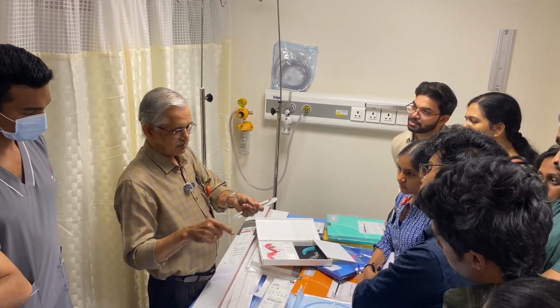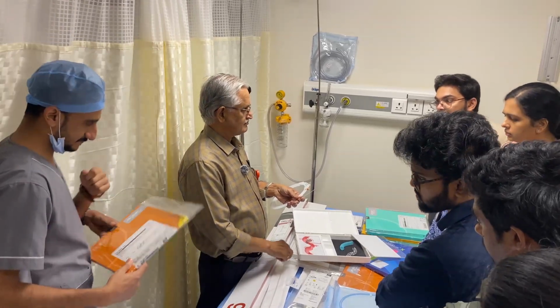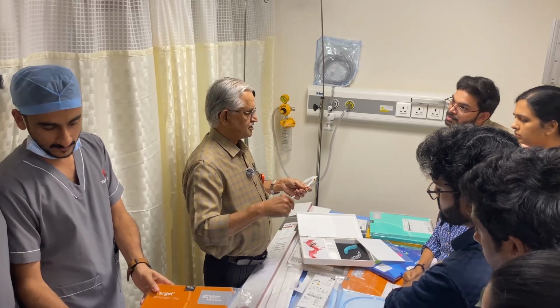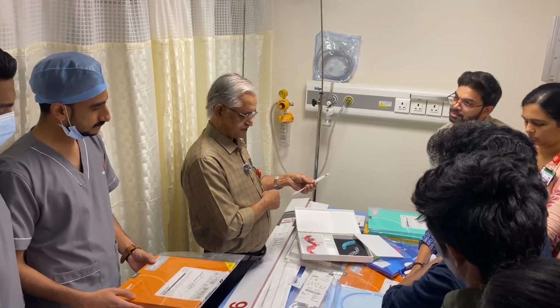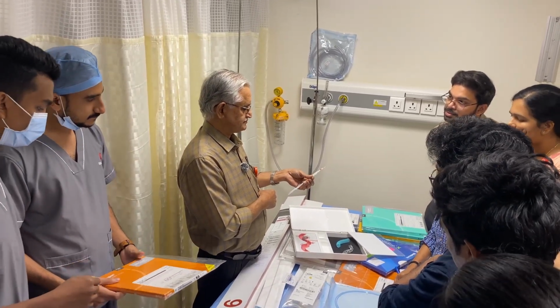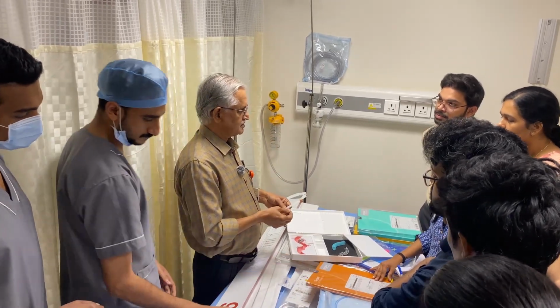It's a bilobed aneurysm. Through a long sheath and then an intermediate catheter, you take the microcatheter, which is very fine, almost 1.4 or 1.8 F, into the aneurysm and place it.